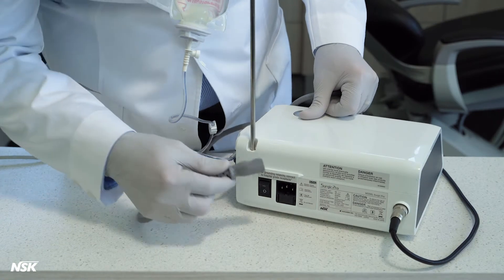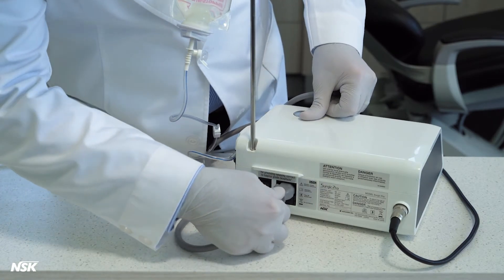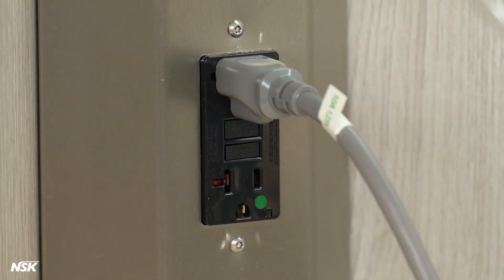Connect the AC power cord to the power socket at the back of the control unit. Then, plug into a power outlet.